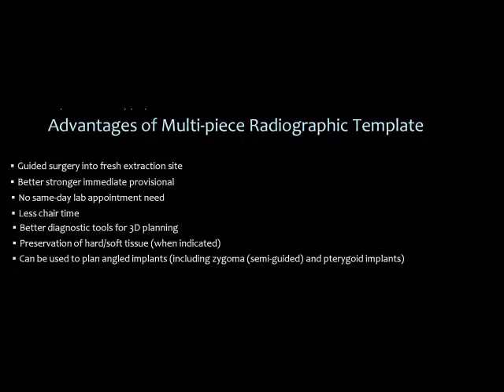It's a better diagnostic tool for 3D planning. You saw how we're able to take these horrible smiles and turn them into these, I think, fairly aesthetic smiles without even trying. It's using the technologies that are available to us right now. And most of all, I think, we can preserve the hard and soft tissue when it's indicated, obviously. It can also be used to plan angled implants, including zygoma in a semi-guided process, and pterygoid implants when there's not a lot of bone.